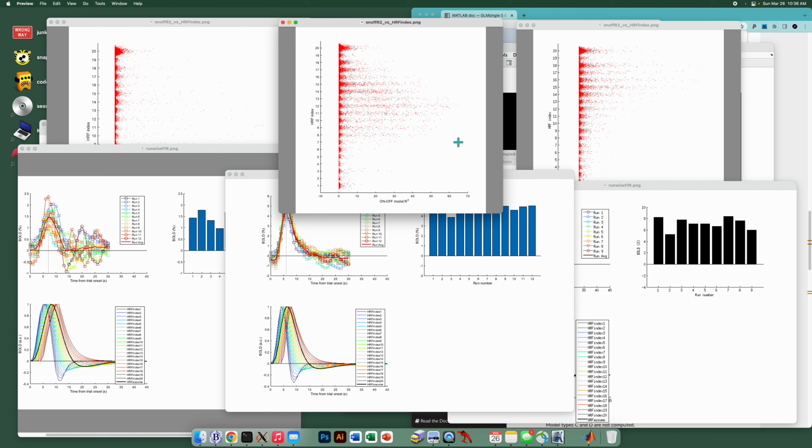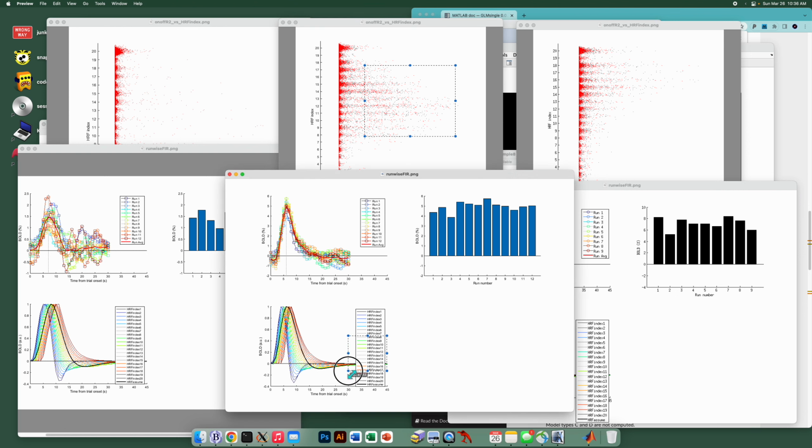Remember, the voxels that have good signals, their HRF indices are indicated here. So similar to the first data set, roughly 8 to 17 or so, which are roughly these colors, greenish to reddish, which is a little hard to see, but you can convince yourself that it is inferring a reasonable HRF library choice, given what we see from the diagnostic plot.